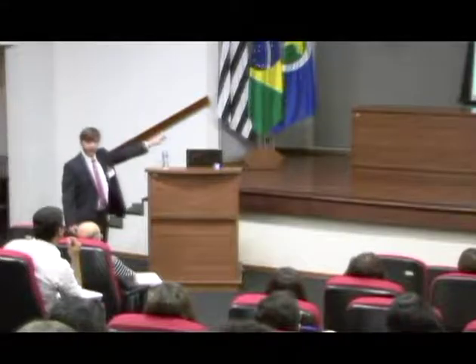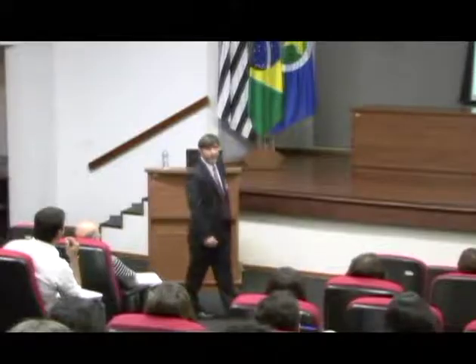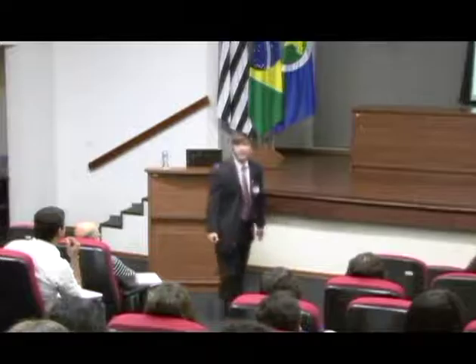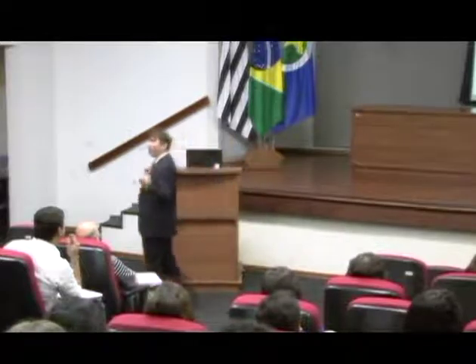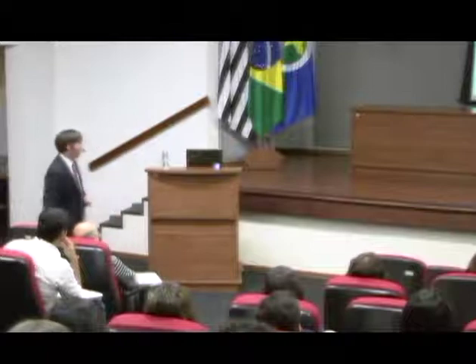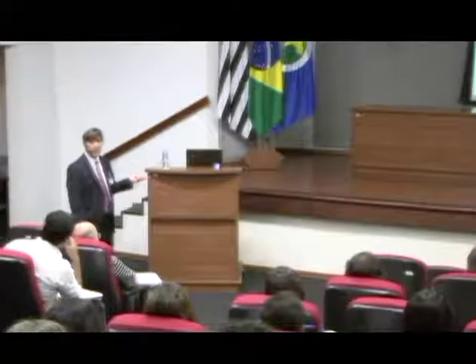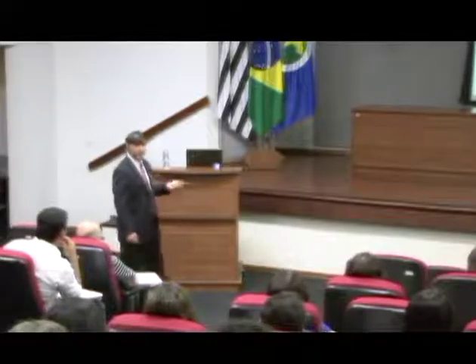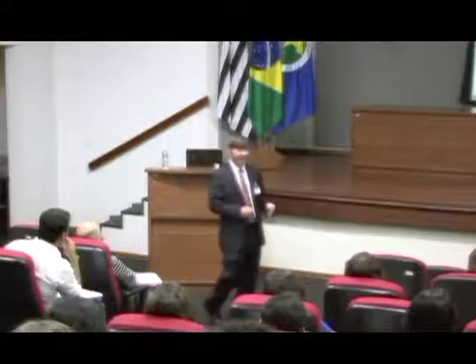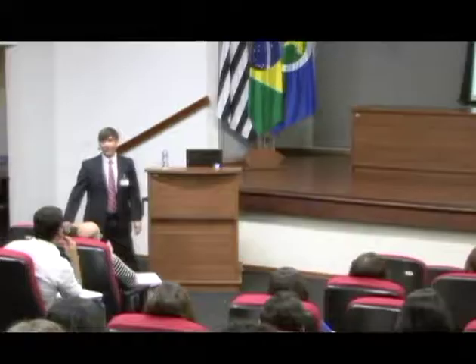And that looks like a pretty good first shot at it. Well, you can certainly do something like this, and you can report that you got 100% sensitivity and specificity. Obviously, that's not going to hold up once you take a larger data set, at least I imagine that it probably wouldn't. And it looks pretty obvious when you look at it this way, but there are many, many cases where people apply quite powerful mathematical techniques to small sets of data and basically do this and report results that are not going to hold up in the long run.